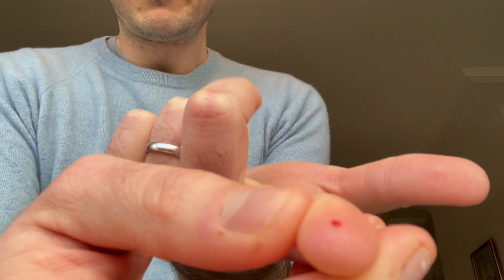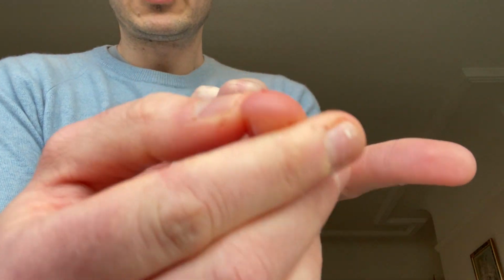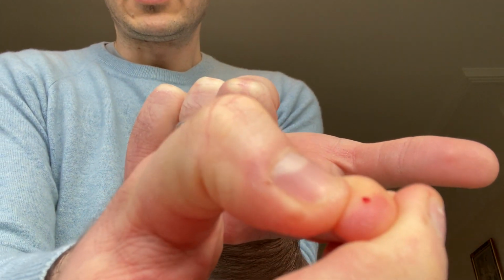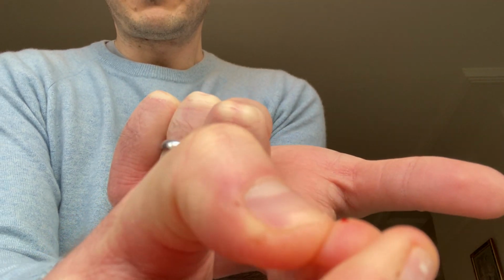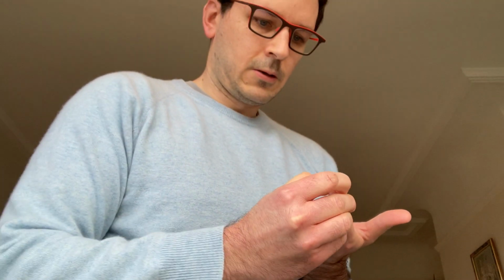So I will just put it on my finger here, pressing here. Ow, ow, ow, ow. Hopefully there will be a little drop of blood. And you can see it here. Just push a bit more. You see, isn't that fun? Blood from your lecturer. Just trying to get a bit more. Let me squeeze my finger.